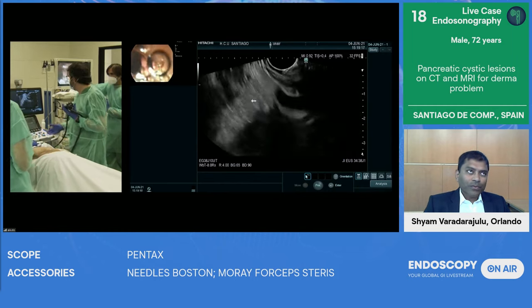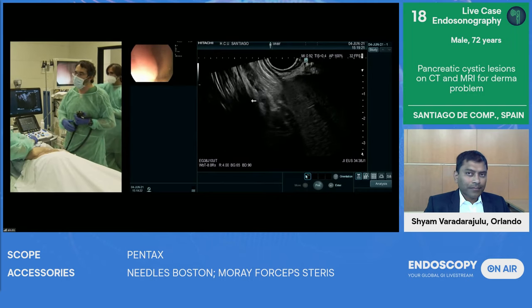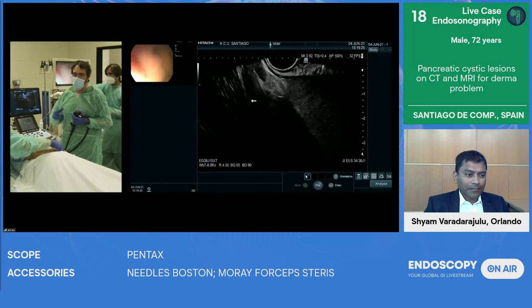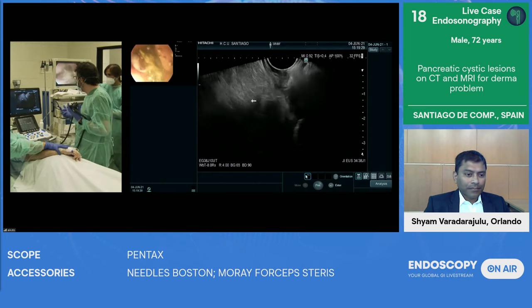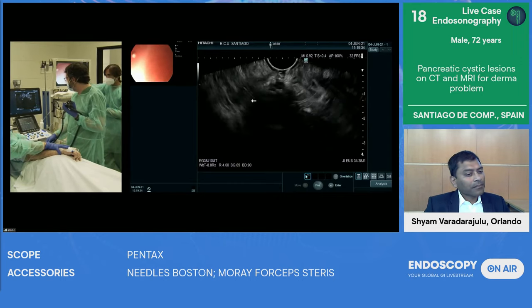We can discuss whether we can use 4.8, 2.4, the half of the complete vial. We usually go for the complete vial because according to the Spanish regulation, it's a little bit complex to split in different patients. And since this is the only lesion that we really want to evaluate, we will give the complete vial at the same time.